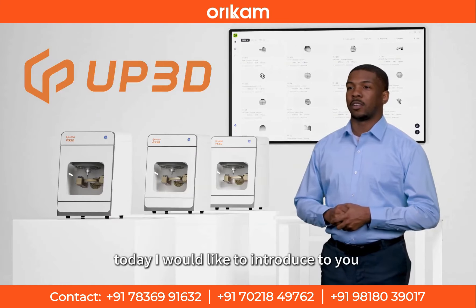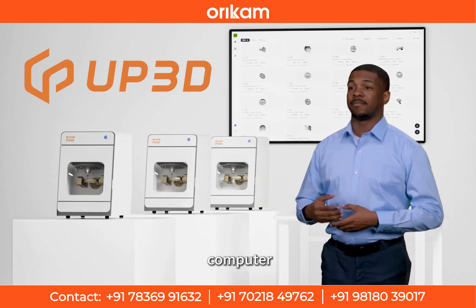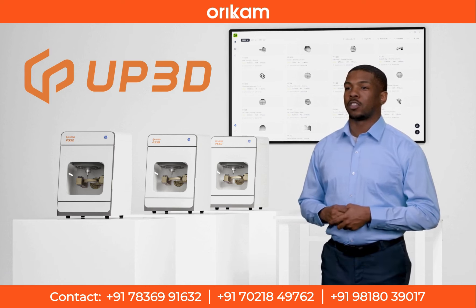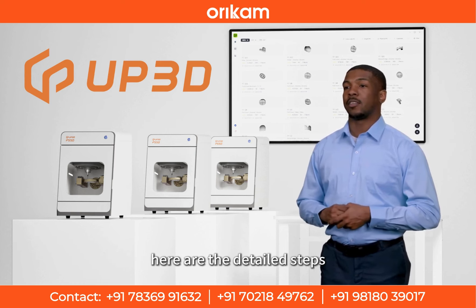Hello, everyone. Today I would like to introduce to you how to connect your mobile phone, tablet, or computer so you can easily control your denture engraving machine at home, just through your mobile device to operate remotely. Here are the detailed steps.